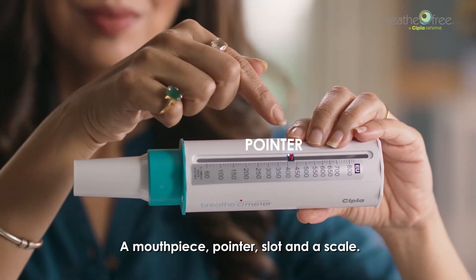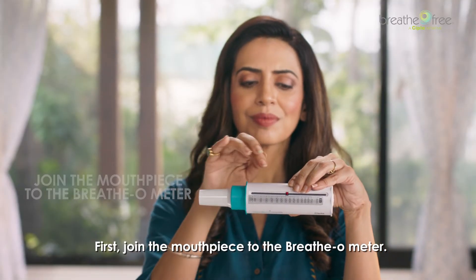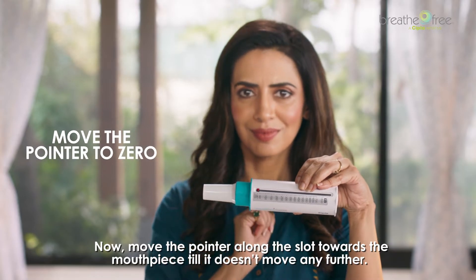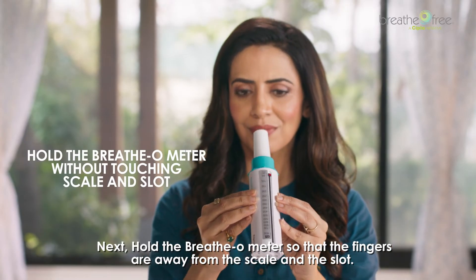A breathometer has the following parts: a mouthpiece, pointer, slot, and a scale. First, join the mouthpiece to the breathometer. Now move the pointer along the slot towards the mouthpiece till it doesn't move any further.